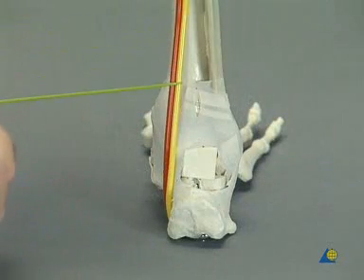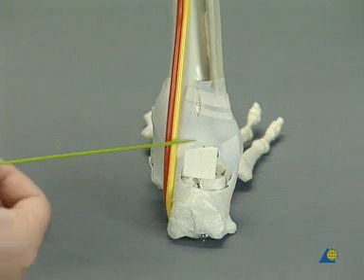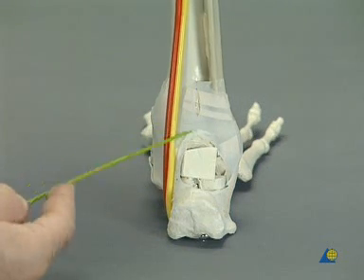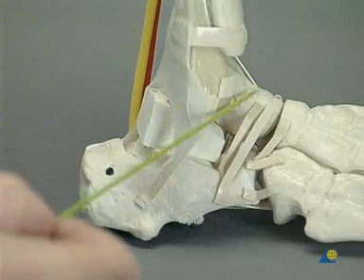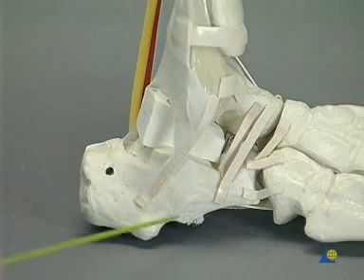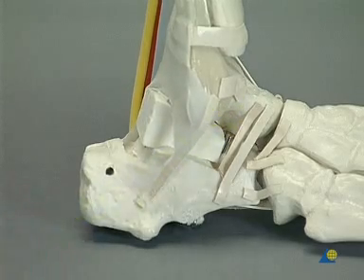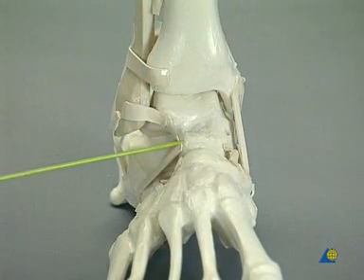After removal of the foam, the exact osteoarticular orientation of the heel is checked. The orientation of the talus and the position of the anterior calcaneo-talar compression screw are also checked. The AP view shows that there is no fibulocalcaneal impingement.